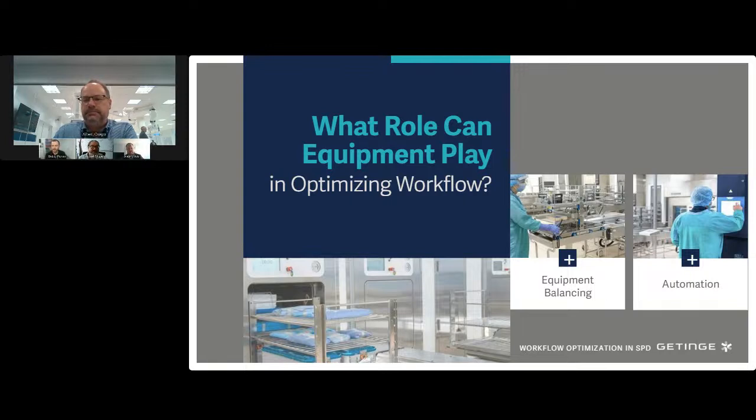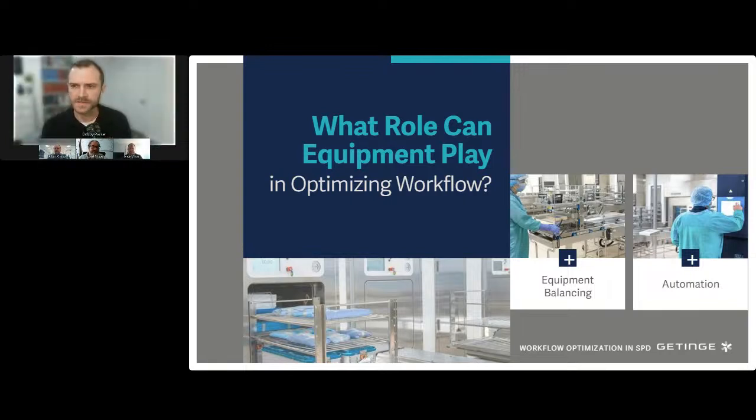Well, yeah, I think that makes a lot of sense, and I think that one's the hard one to pitch to administration in the project, the one beyond our workflow requirement, but it is so important. Every sterile processing technician has been there on the day when the one cart washer goes out, and that is a miserable experience trying to keep workflow moving through decontamination. And so having that redundancy is really important.